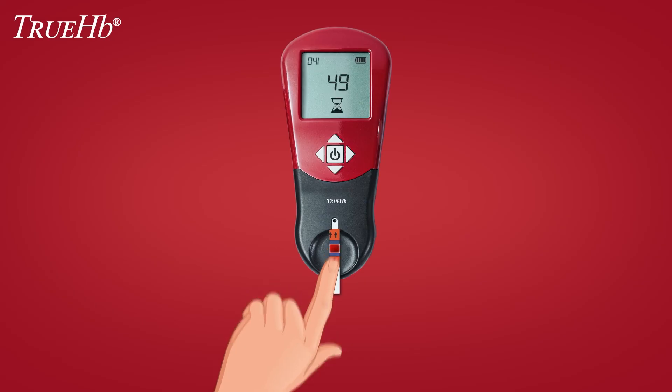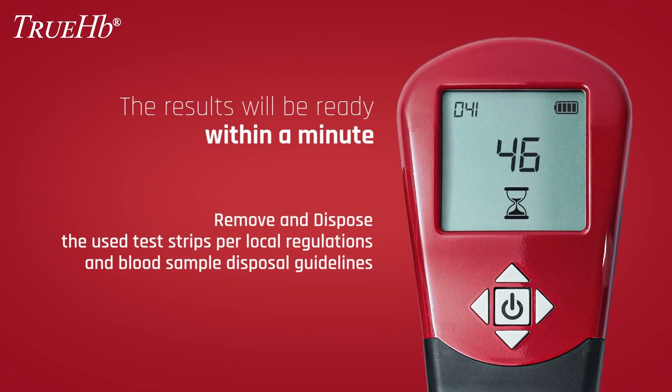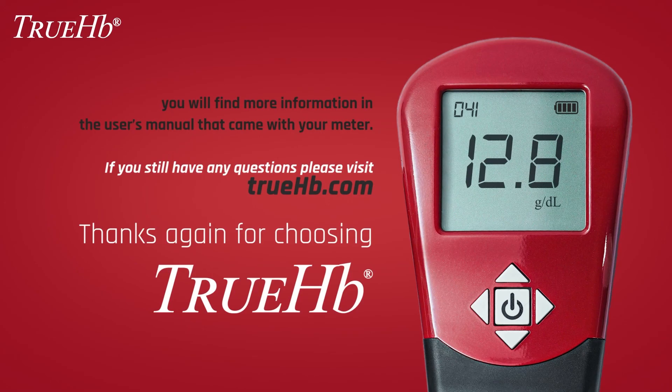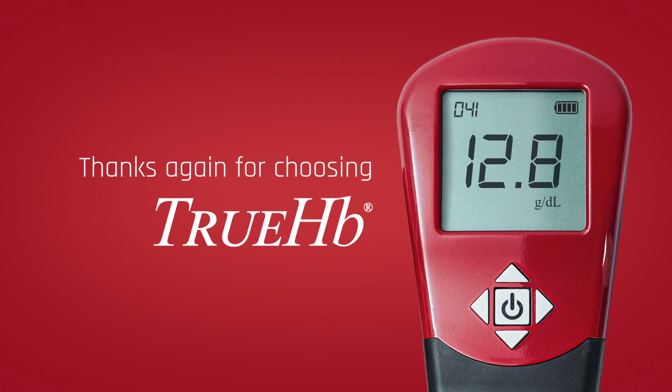When enough blood has filled the test strip, the flashing hourglass appears and the results will be ready within a minute. Remove and dispose of the used test strips per local regulations and blood sample disposal guidelines. You will find more information in the user's manual that came with your meter. If you still have any questions, please visit TrueHB.com. Thanks again for choosing TrueHB.